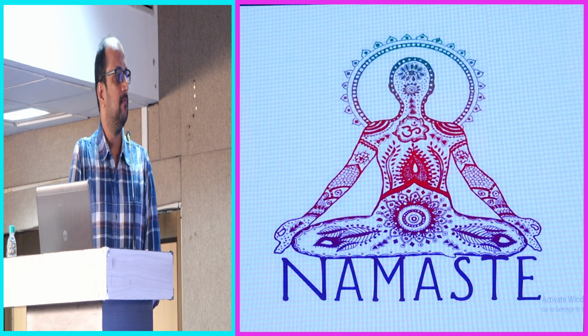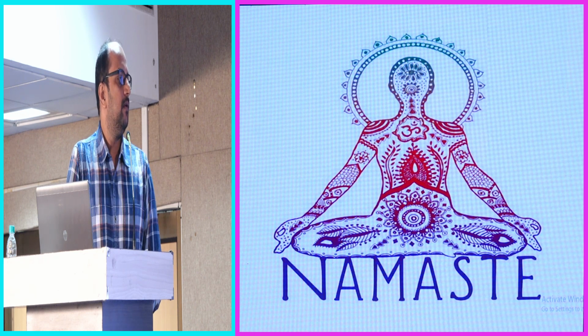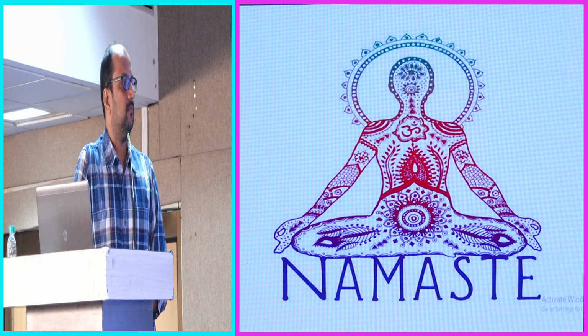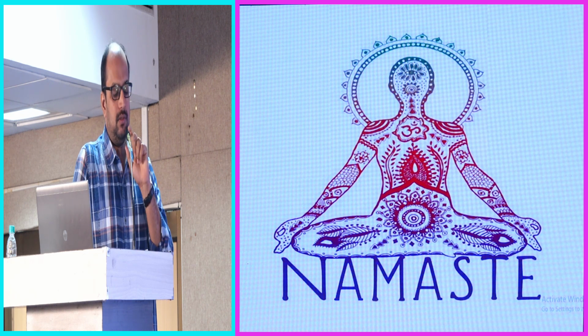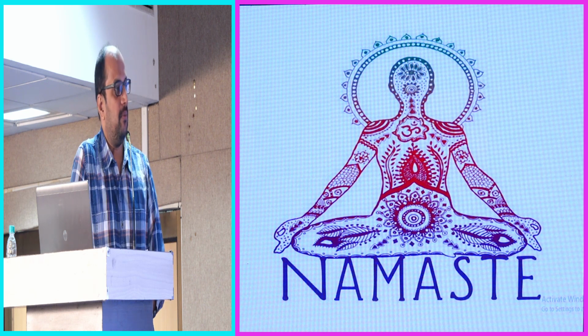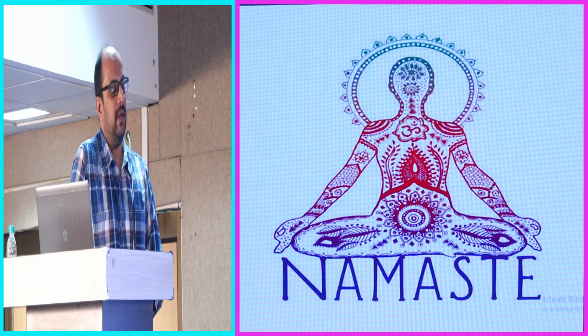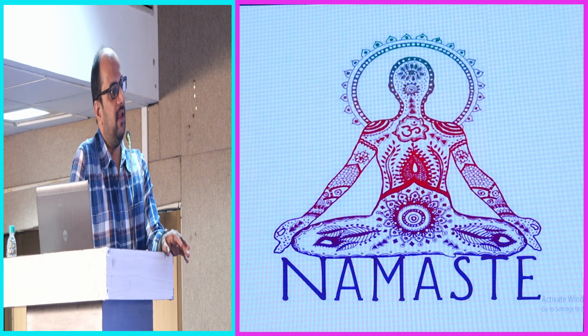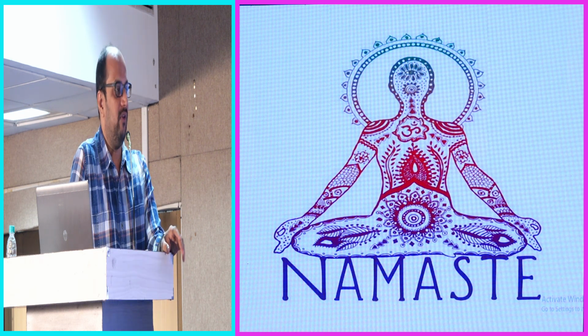So, excellent talk, Dr. Mahesh. What is your experience using regional citrate for those who developed heparin-induced thrombocytopenia due to heparin? It is always a better option if someone develops heparin-induced thrombocytopenia, sir, because the patient should receive proper anticoagulation. If you do not give any anticoagulation, the circuit will clot.